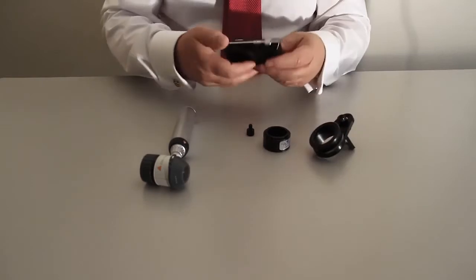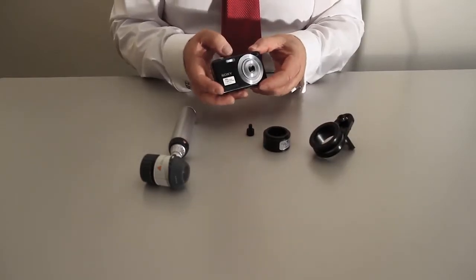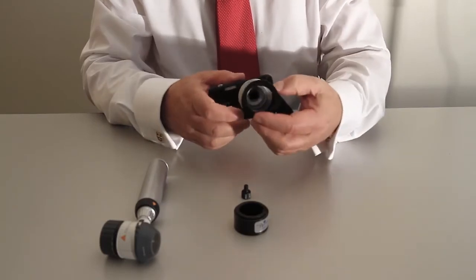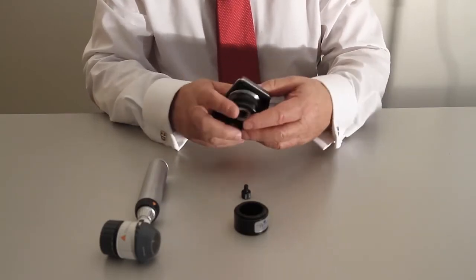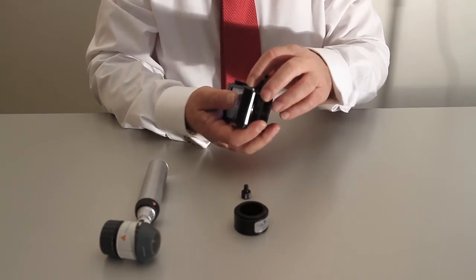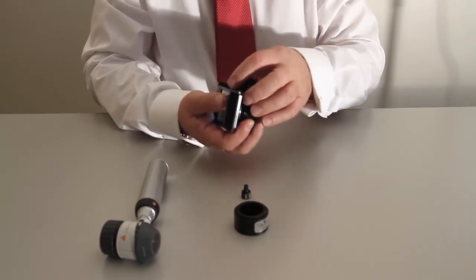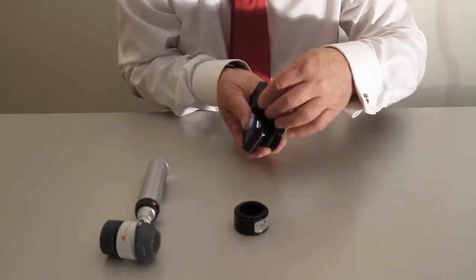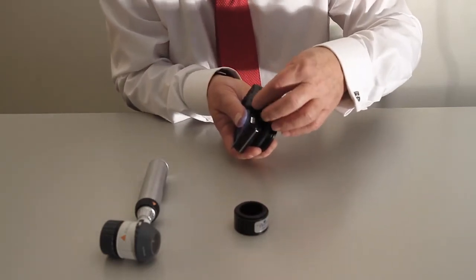You then take your camera and you turn it on. And you take the bracket and lay the aperture over the lens like that, and the plate at the back should just fall neatly over the screw hole. Then with the same screw you just removed, you attach it to the camera and do that up nice and tight.